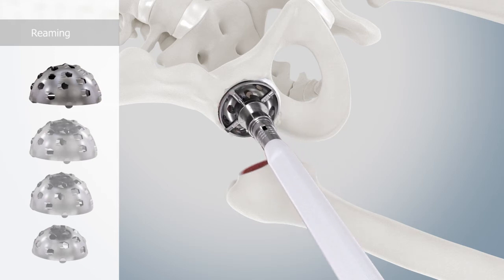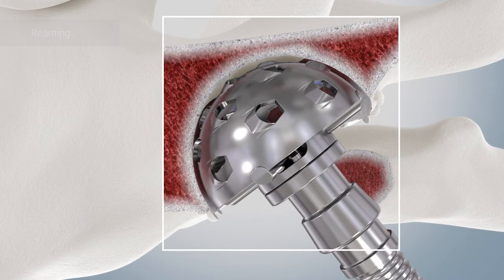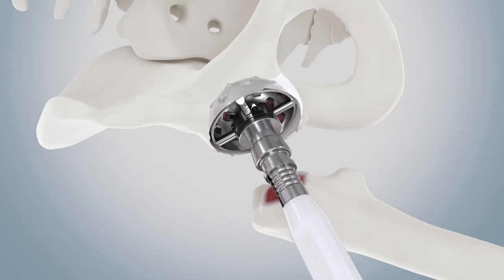If the desired depth is reached already upon definition of the center of rotation, it is likewise recommended to only widen the acetabulum without exerting excessive pressure on the reamer. Thus, further medialization and cranialization of the center of rotation can be avoided. The anatomical landmarks in situ must also be taken into account here.